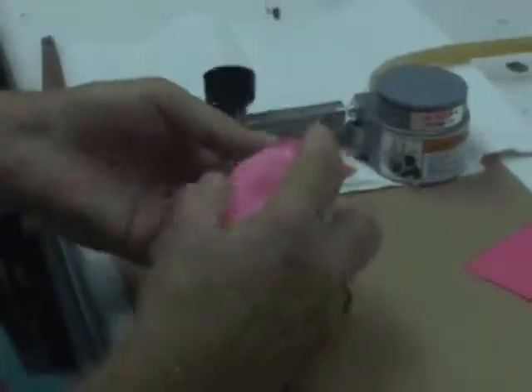This can be used for full dentures as well, this technique. This was developed for full dentures, and I've modified it. This technique, it's the old Swissadent technique for overdentures.